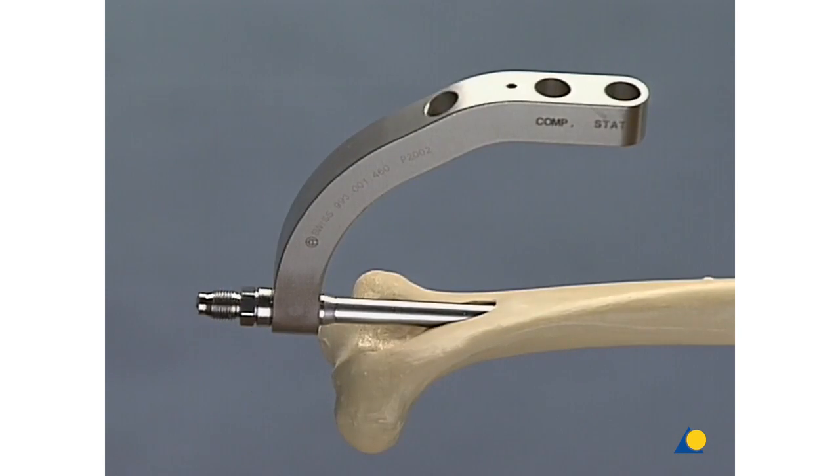To check the depth of the nail, insert a 3.2 millimeter drill bit through the hole in the insertion handle.